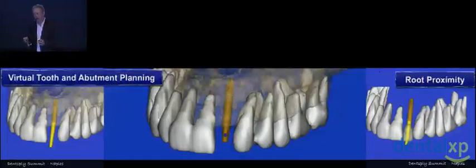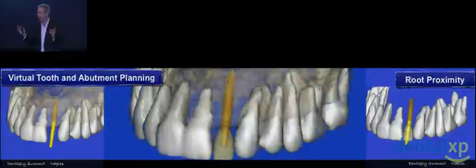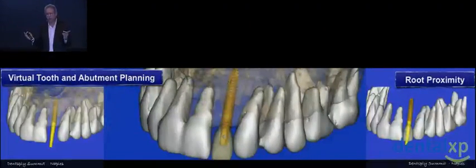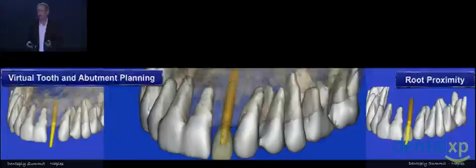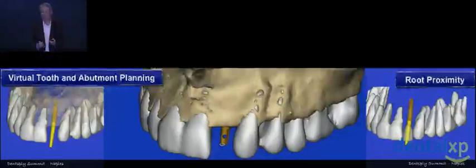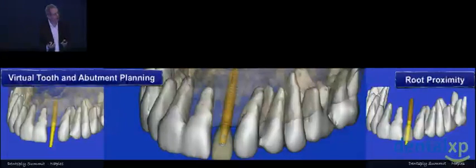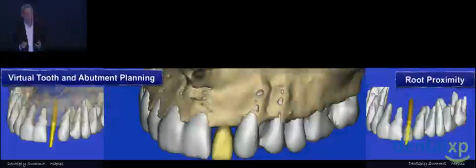And having that capability, imagine where we are going from the digital world, going from placing this digitally on this three-dimensional reconstructed view. Can we go from this image directly to CAD-CAM abutments and CAD-CAM crowns? And of course, we've done that already. It's just not been a priority for the companies to invest the time to be able to get to where we could be, and I hope that this new relationship may push us forward.